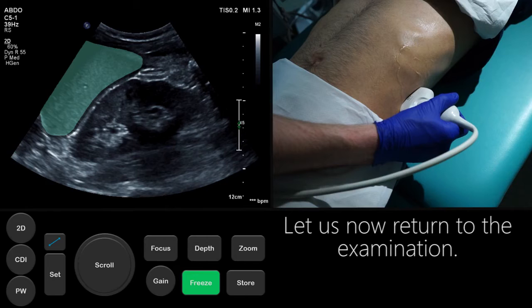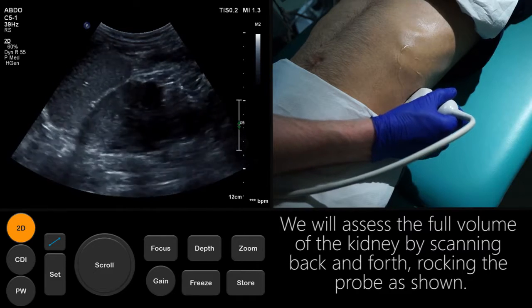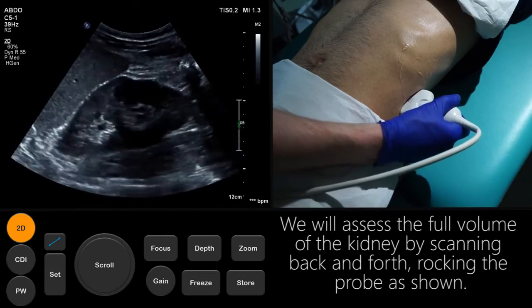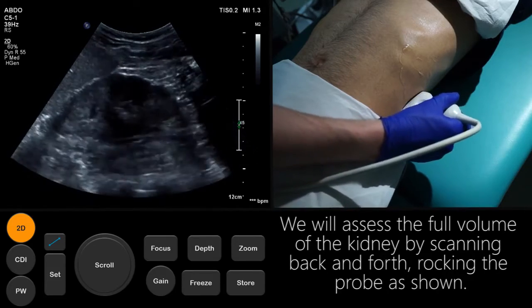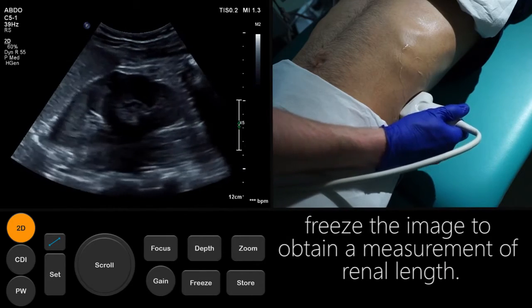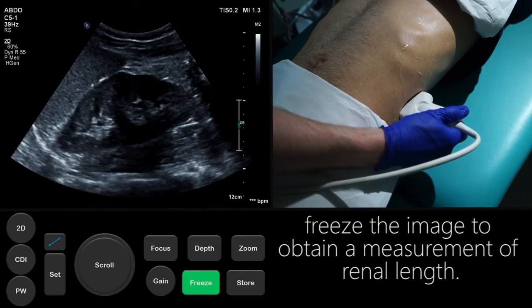Let us now return to the examination. We will assess the full volume of the kidney by scanning back and forth, rocking the probe as shown. With the probe along the kidney's central long axis, freeze the image to obtain a measurement of renal length.